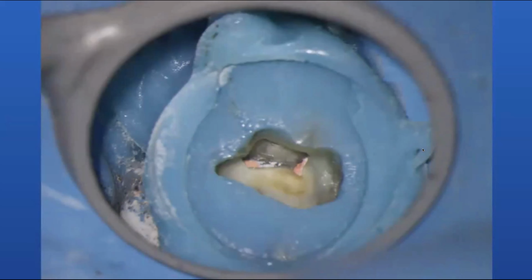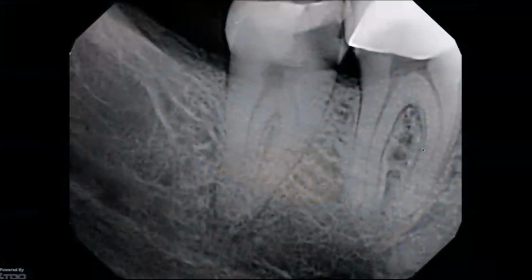That person's name is Michael Trudeau. So I pay him homage every time I show these ideas because in this case, seeing as though we're already using the sound seal in order to create that closed loop system, all I've been doing is cutting back in order to create a casing for our materials to set, and then for us to be able to place the margin.